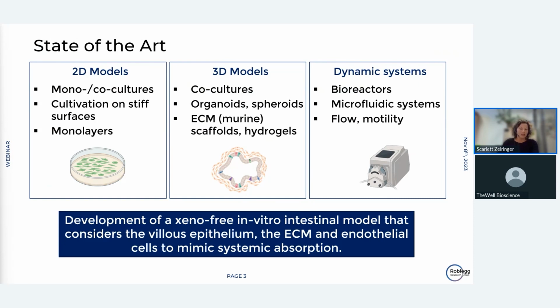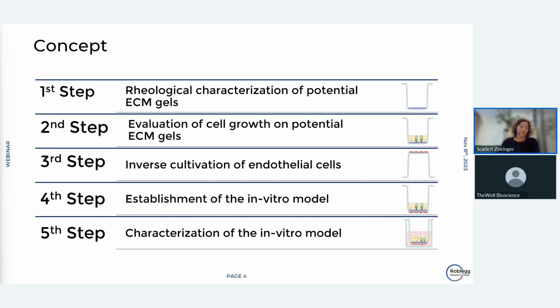Further, it was important to develop an animal-free system to exclude any unwanted interactions, as animal-derived hydrogels are often not precisely identified with regards to their ingredients. Batch-to-batch variations can occur, leading to unwanted interactions when brought into contact with human cells, for example, leading to immunological reactions. This brings me to my workflow.